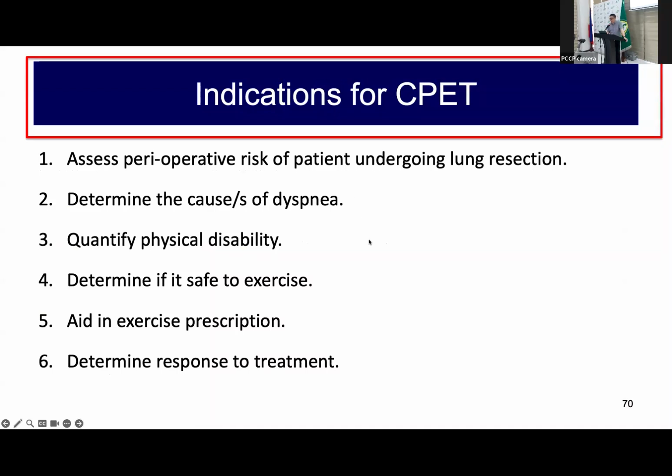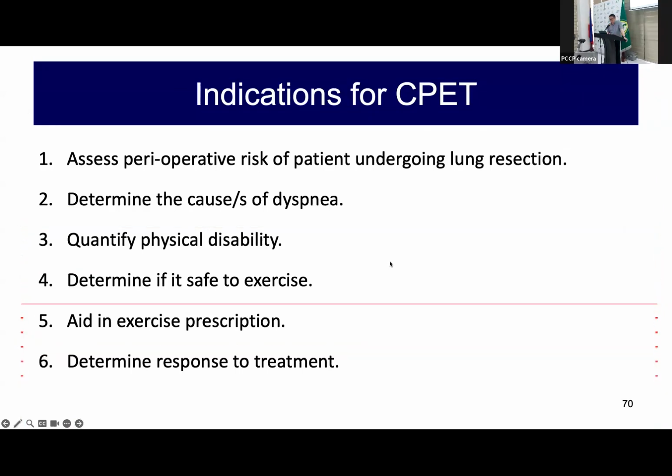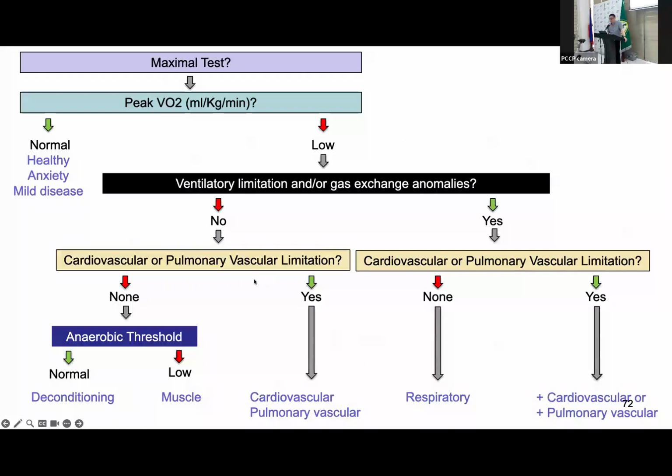So here are the indications of CPET. I won't repeat what Bernice mentioned. And it is applicable in our patient. Okay, and these are the different, complicated algorithms. And what I want to use is the simplified one for the ERS. Okay, let's dissect this one.